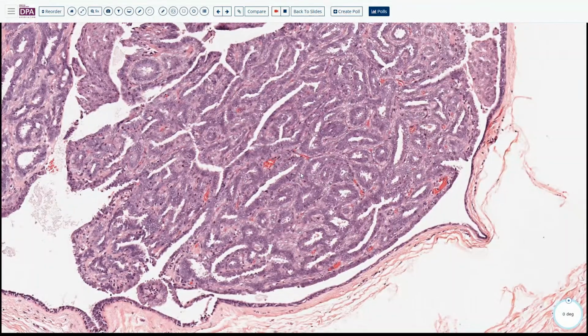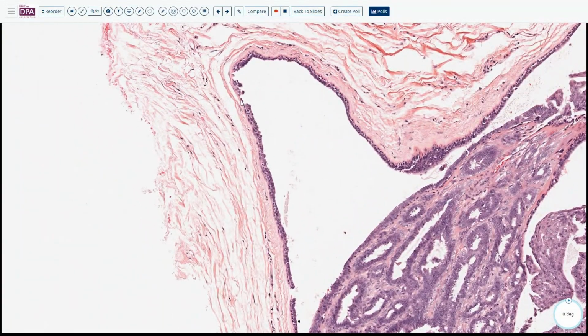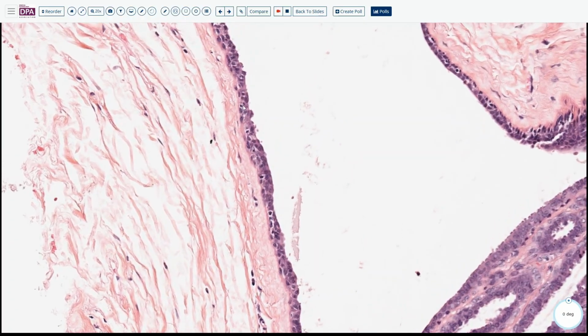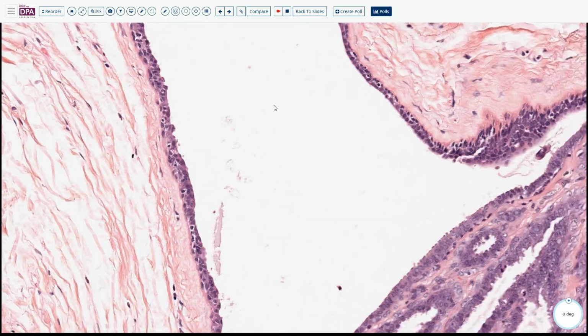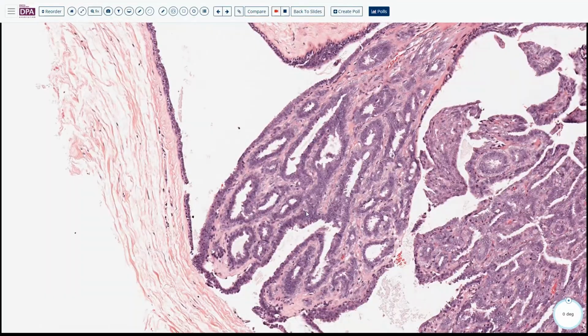So they don't look like architectural atypia. And then, of course, when you see this perfectly well circumscribed outside layer, you need to see whether we can find the myoepithelial cell. They usually have maybe a little bit darker nucleus. You can appreciate we have a different population. Usually they have this clear cytoplasm compared to the luminal cell. So all of these are myoepithelial cells on the outside. So far, at least from here, we know this is not an invasive carcinoma, but it could still be DCIS.